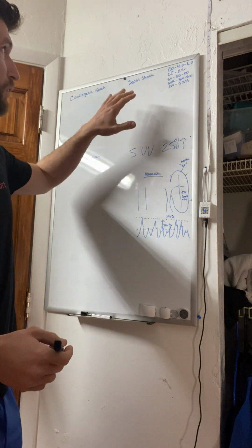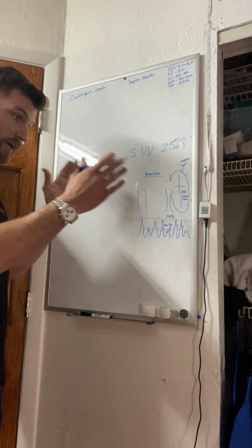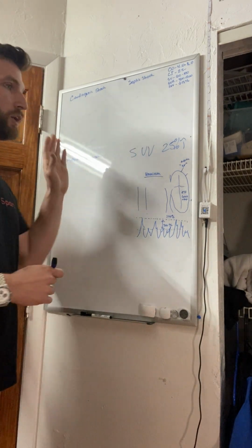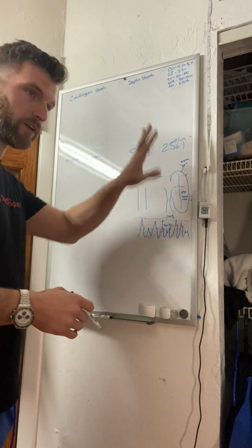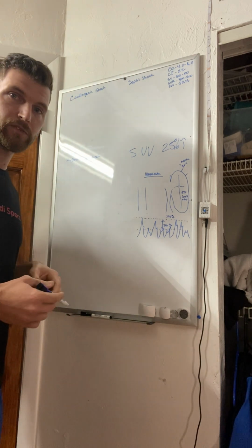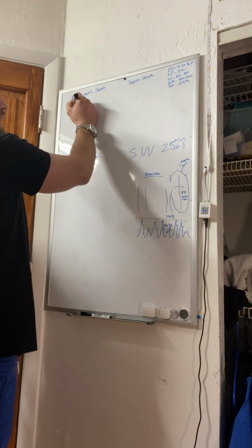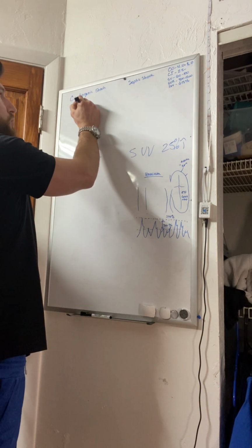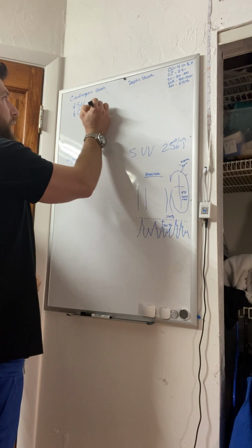So, cardiogenic shock, what are some of the symptoms or signs that you would see on the monitor really quick? Your patient's hypotensive. That's the key thing. In all of these scenarios, the patient's hypotensive, okay? If they're not hypotensive, this isn't going to tell you a whole lot. So, cardiogenic shock, you're going to see a decreased stroke volume, a decreased cardiac output, cardiac index.